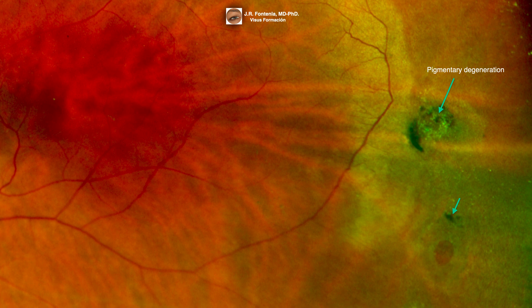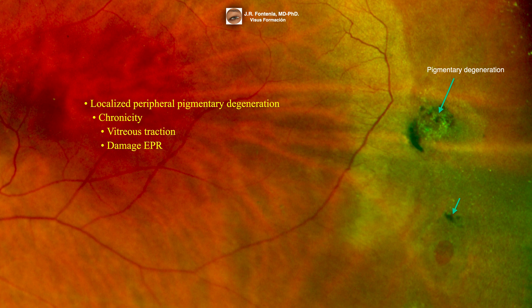Here we can see a localized peripheral pigmentary degeneration. Pigmentary degeneration reflects chronicity. The pigmented appearance indicates the soft and chronic traction of the vitreous at the attachment. The constant vitreous traction ends up causing damage to the retinal pigment epithelium. This lesion can be found associated with different types of peripheral retinal degeneration.